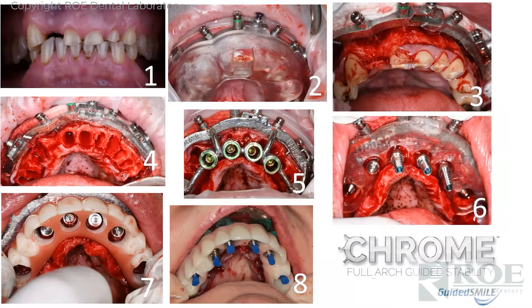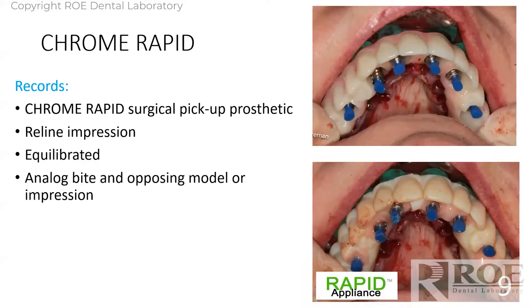Sorry for the lunchtime gore, but here's the process in a nutshell: guided surgery where we control the bone reduction, the implant placement, the temporary cylinder pickup, and prosthetic delivery — all in a few hours.